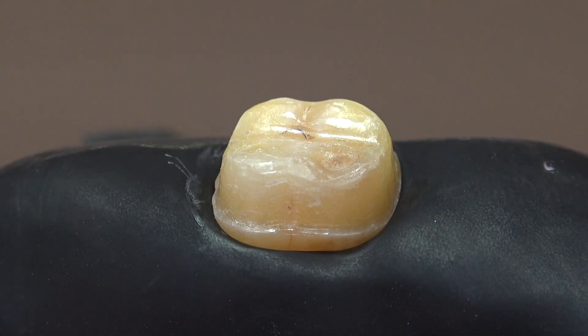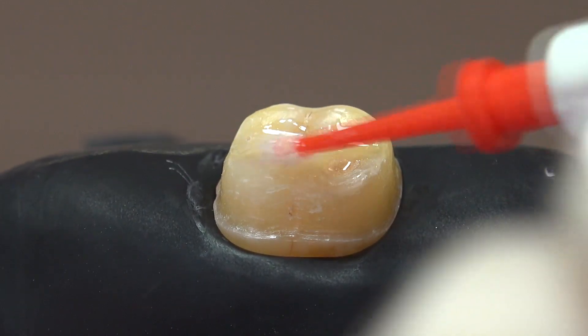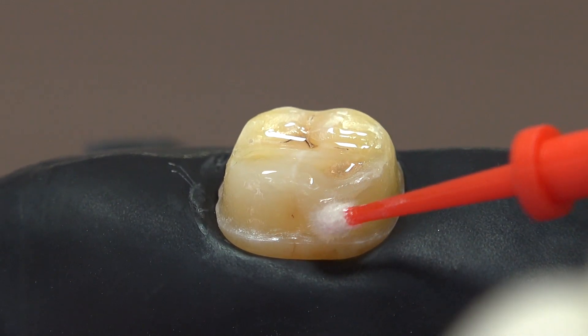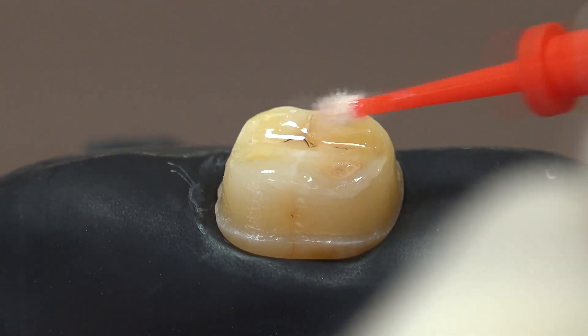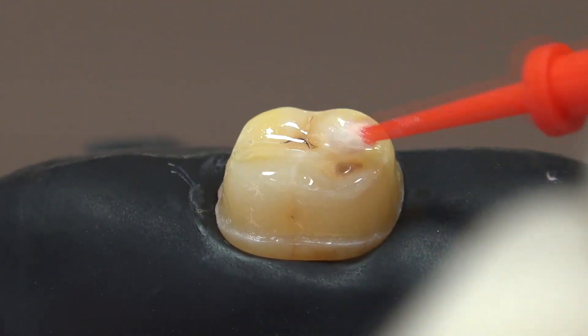Immediately after tooth preparation, we apply a low viscosity flowable self-etch primer on the dentin surface and rub it preferably for 20 seconds. At this stage, we pay attention not to interfere with the enamel layer, which is not an easy practice. The smear layer cannot be removed by an approximately pH 2 acid, and moisture control becomes easier.